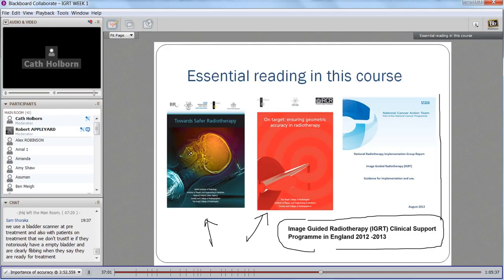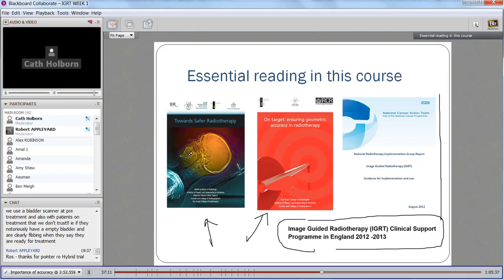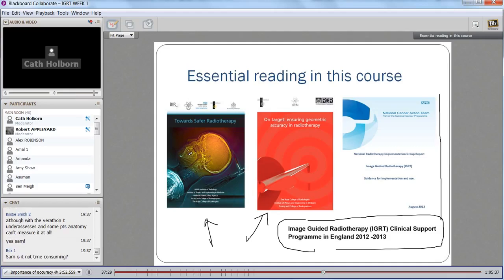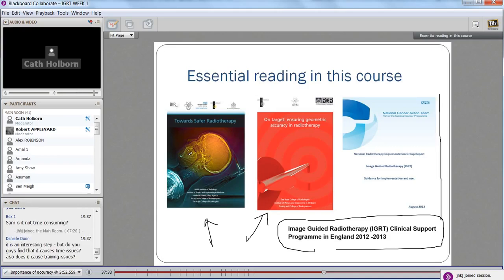So obviously, for prostate, a lot of departments will require that the patient has a full bladder. I think the idea is that the radiographers would do an initial ultrasound scan and compare the bladder volume on the ultrasound scan to the bladder volume when it was originally planned. They wouldn't go as far as actually registering the two images and measuring a precise error, but they can see, in a more crude way, how comparable the two volumes are.